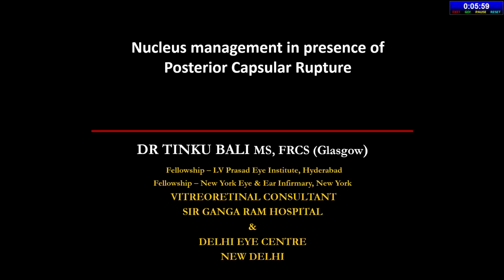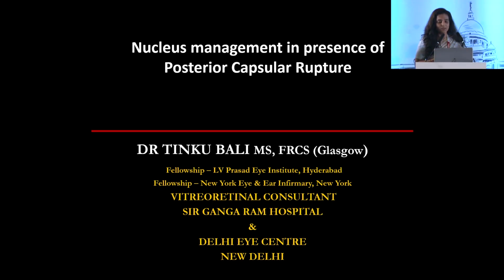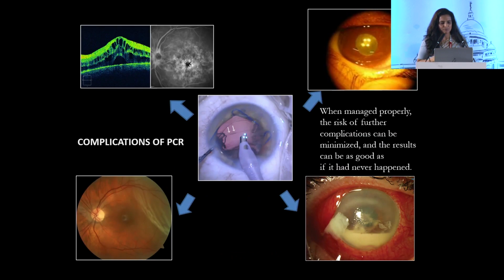Hello, good morning everyone. It's my pleasure and privilege to be here this morning. And I'll be talking on the nucleus management in the presence of a posterior capsular rupture, and I'll be giving you more of a vitreoretina perspective since I'm a vitreoretina surgeon.